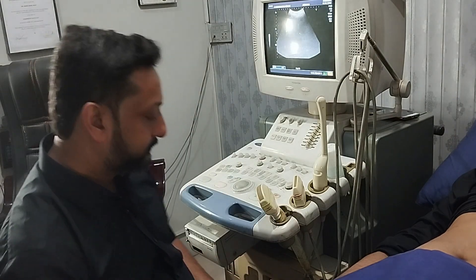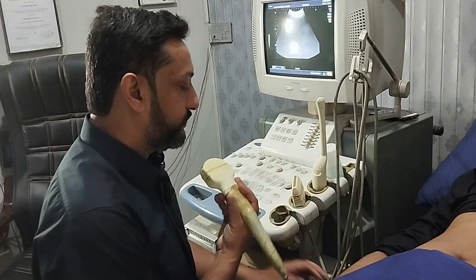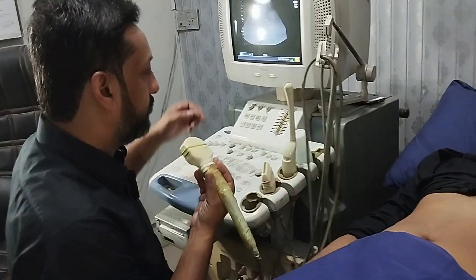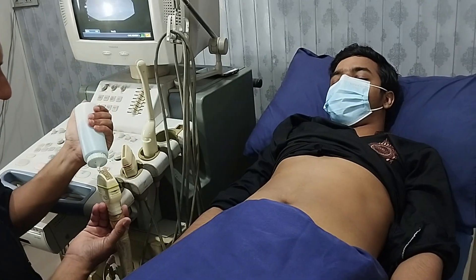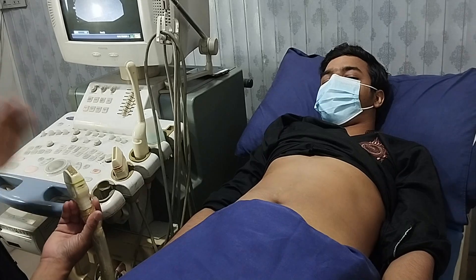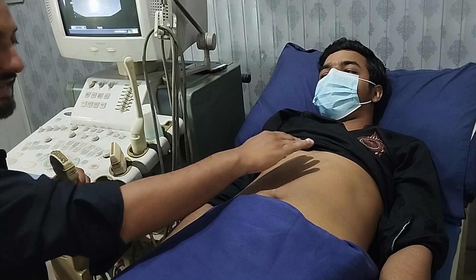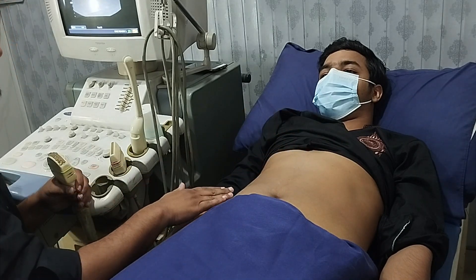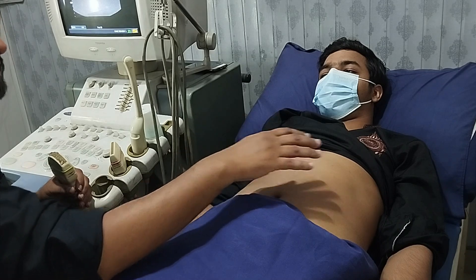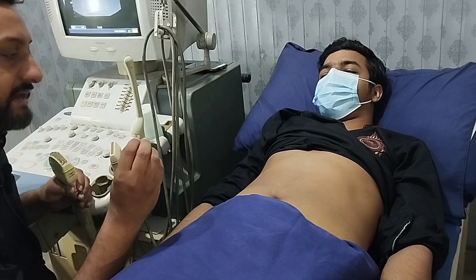Coming to the ultrasound machine, for abdominal ultrasound we are going to use our curved array probe. We will apply the gel, and as we know we can divide the abdomen into different regions like the epigastric region, right hypochondrium, left hypochondrium, lumbar region, and umbilical region. I recommend that you start the scan from any one point and then move to the other points in sequence.